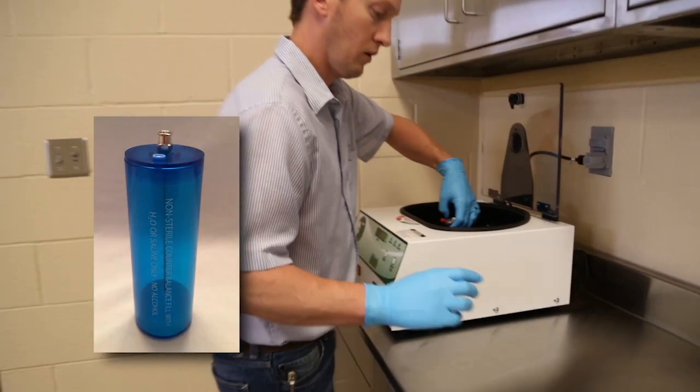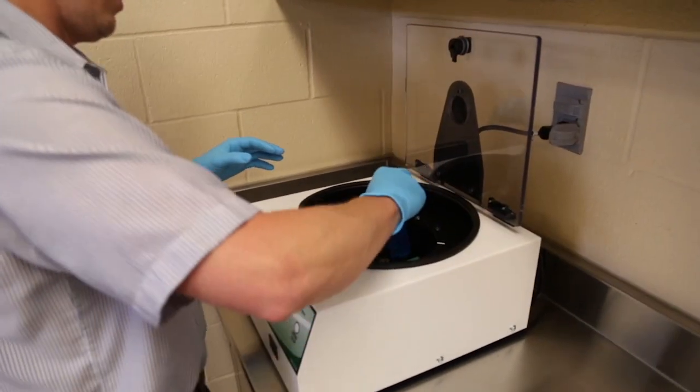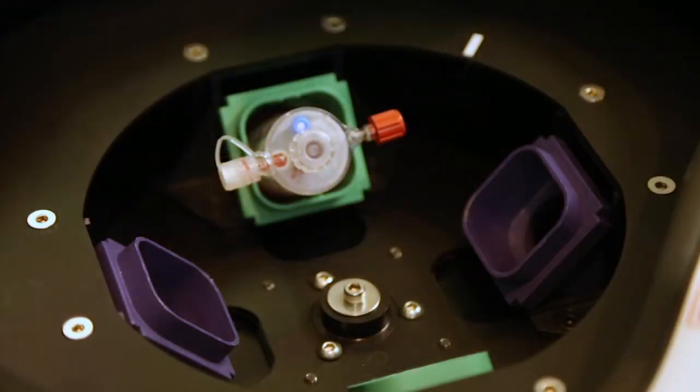Make sure to load the device with the ports placed horizontal, facing left and right, and not vertical. The green centrifuge buckets must be used with ProStride. It is critical that the centrifuge is balanced.